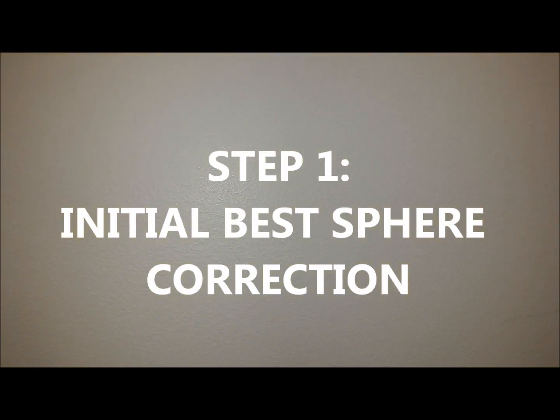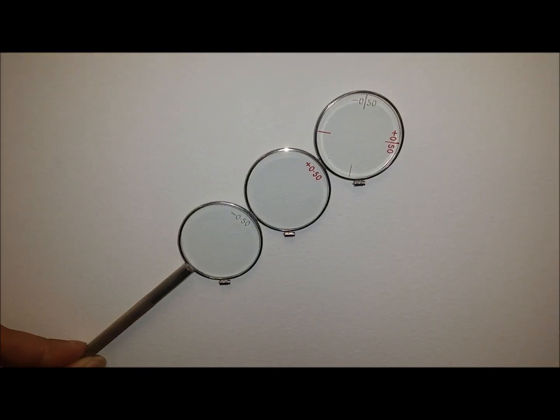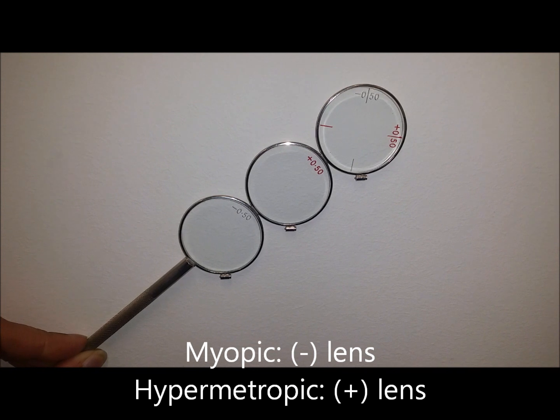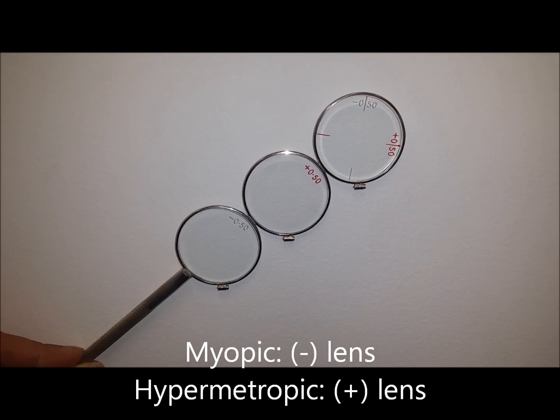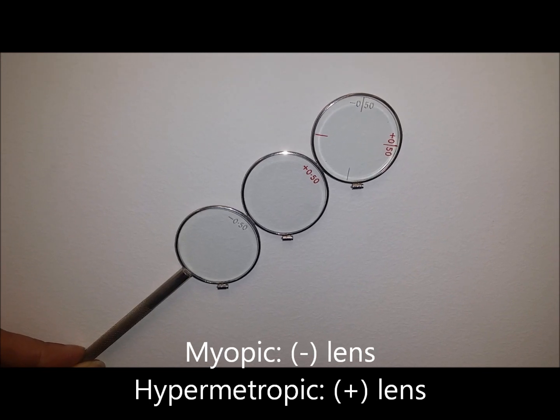Step 1. Initial best sphere correction. A patient without astigmatism should be fully corrected after this step alone. However, if astigmatism is present, the aim of this step is to position the two focal lines so as to straddle the retina. This is known as the circle of least confusion. First, we need to establish whether the patient is myopic or hypermetropic, therefore determining the need for a minus or plus lens to correct their refractive error.